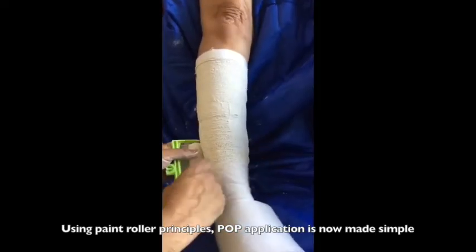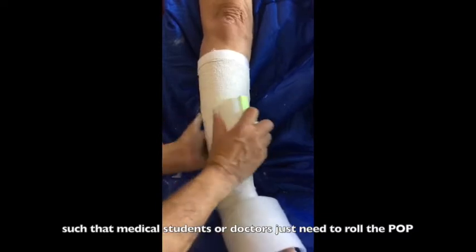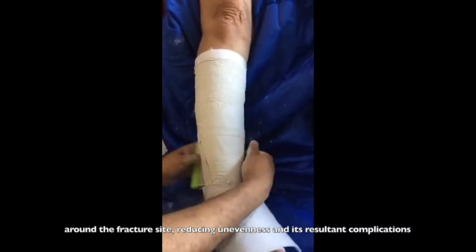Medical students or doctors just need to roll the POP around the fracture site, reducing unevenness and its resultant complications.